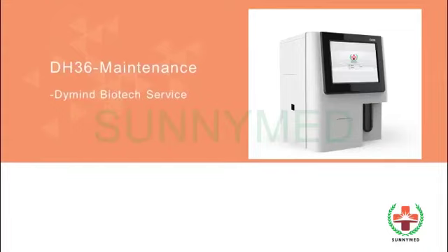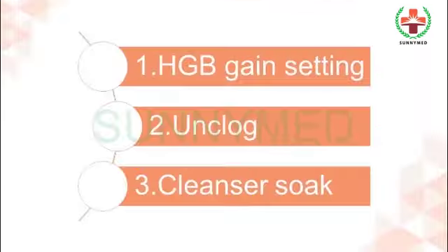Welcome to the DH-36 maintenance guide. Here is the overview — there are totally three steps. Step 1: HGB gain setting.